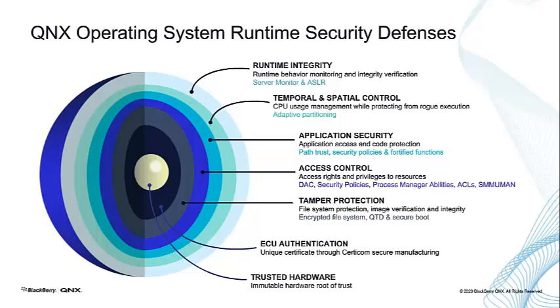And then ensuring the temporal and spatial control, the operating system is going to do that as part of its course, but making sure that you've minimized access and you don't allow a system to just run away with the processor, either in taking as much memory as it wants or taking as much time as it wants. That could have an adverse effect on the system. And then ensuring that the runtime is actually doing its job all the time. So yes, you can check periodically to ensure that the load has not been tampered with and everything is running as you would expect it to.